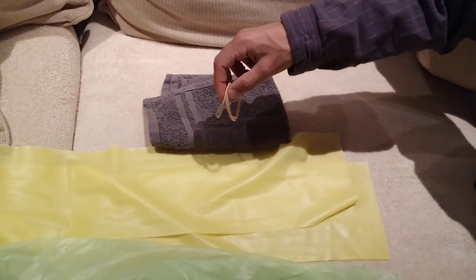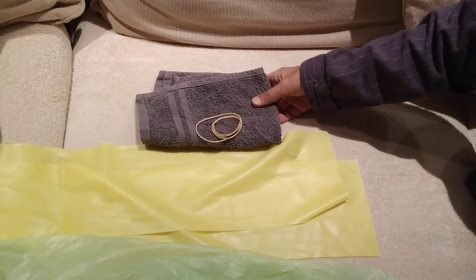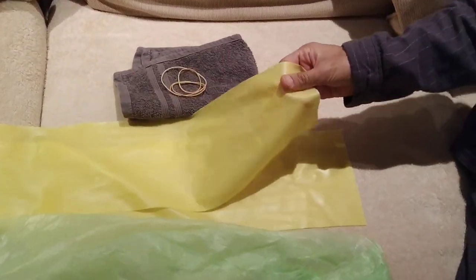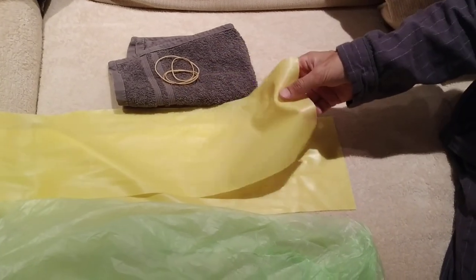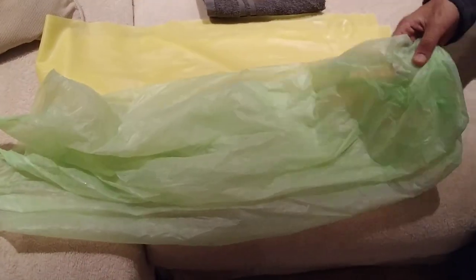To make a waterproof appendage cover if you have a broken leg or arm and a cast, you need some rubber bands, a cloth, this silicone strap or yoga band — which is important — and a plastic bag large enough to cover your cast.